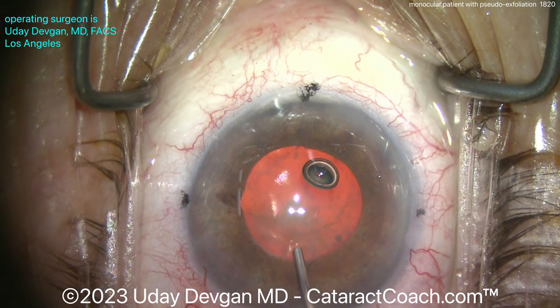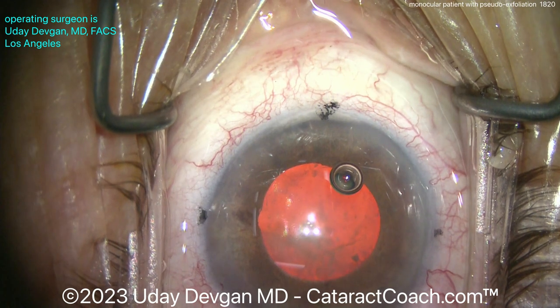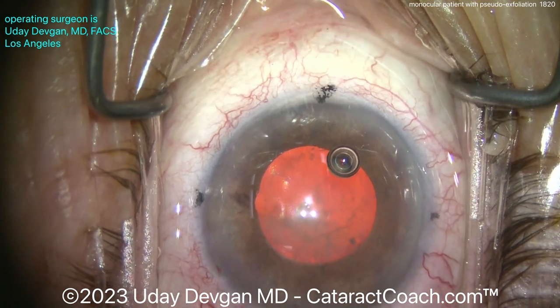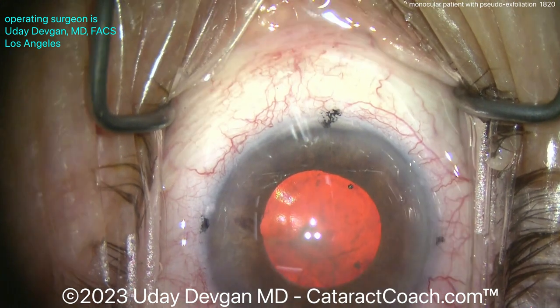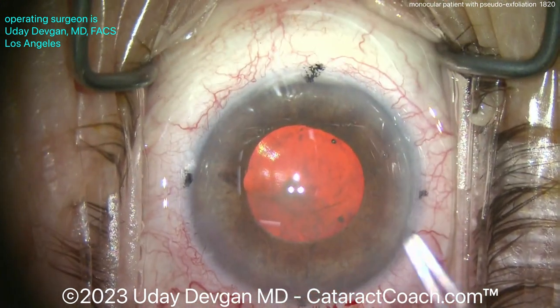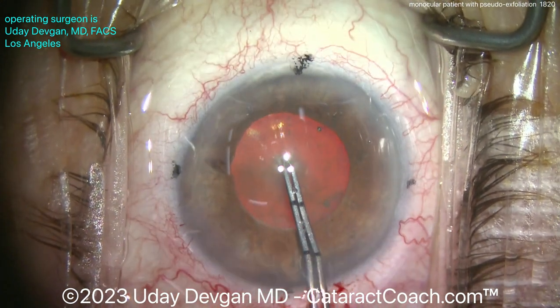You can see a little iris sphincter tear to the left of the screen at about the nine o'clock meridian. That's much better, and look how the red reflex improved as we're able to get more of the coaxial lighting posteriorly deep into the eye and into the vitreous cavity. Now we can see and have a reasonable pupil — let's measure, it's about five millimeters.